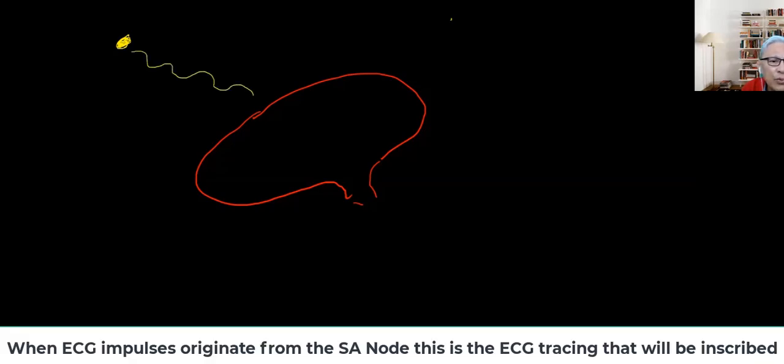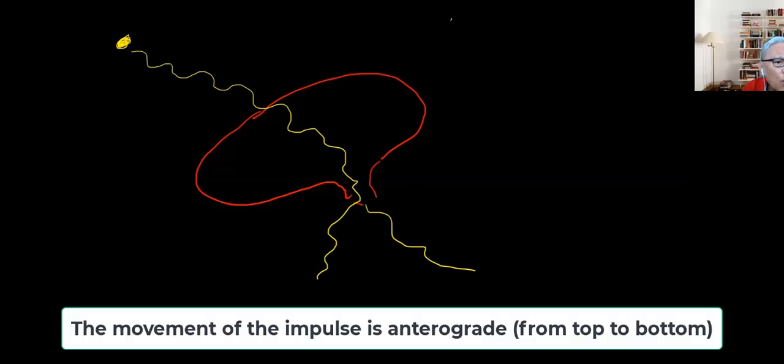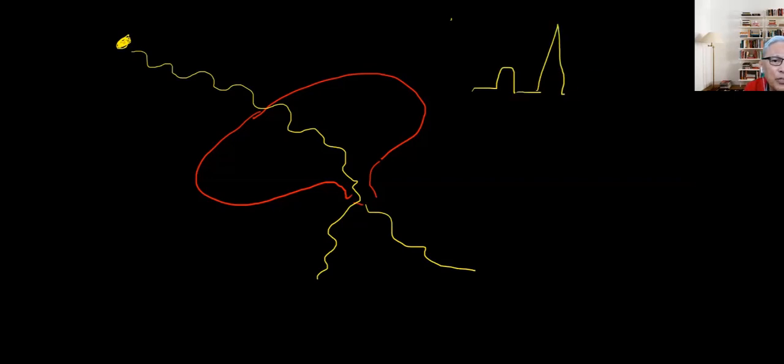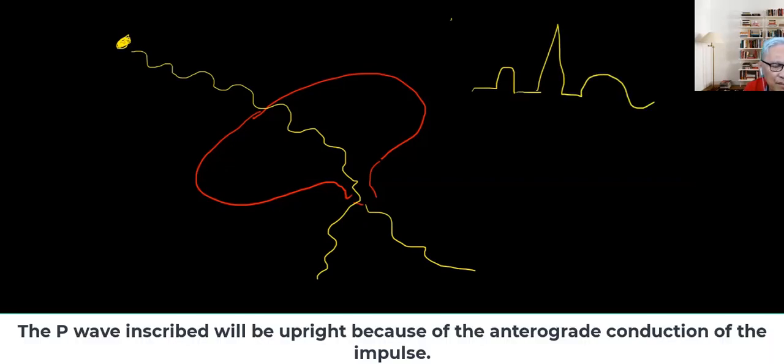Let's say now that a waveform originates from the sinus node. It goes into the atria, into the AV node, into the bundle branches, and then onto the Purkinje fibers. What happens to the P wave? The P wave is a positive waveform, so it will result in something like this.